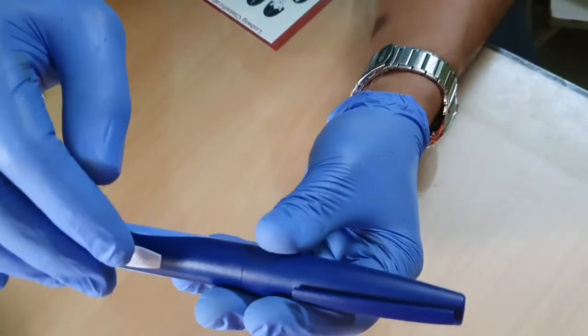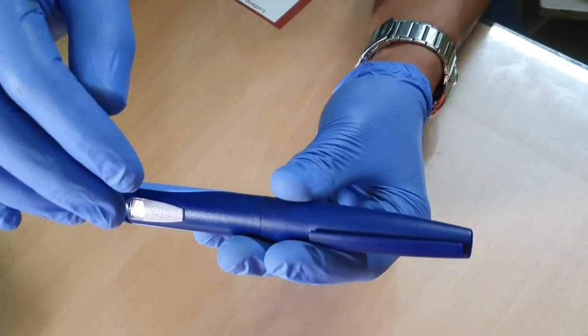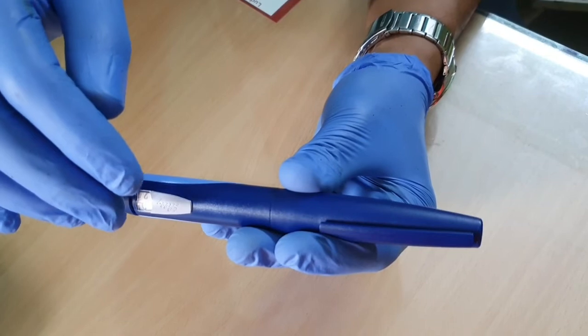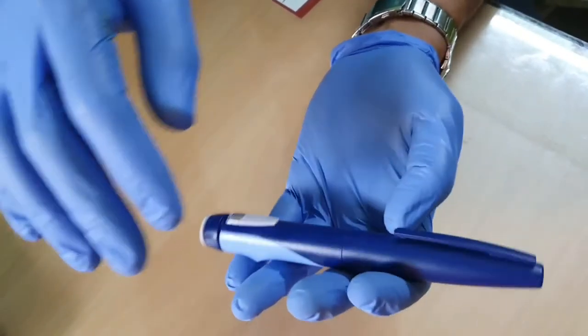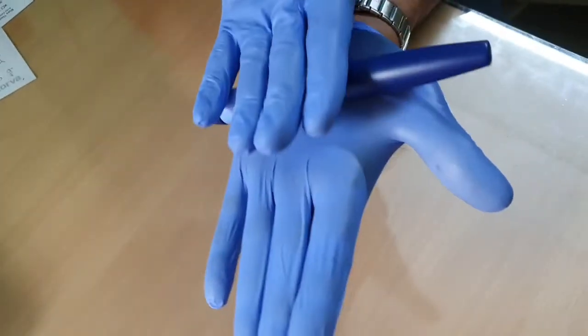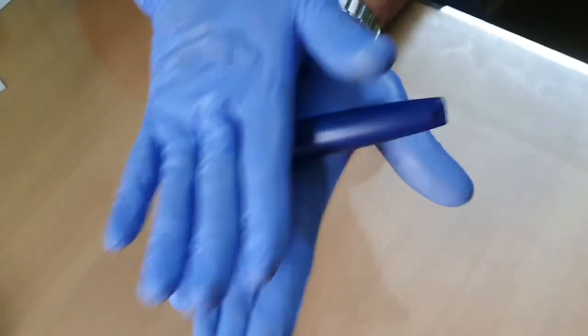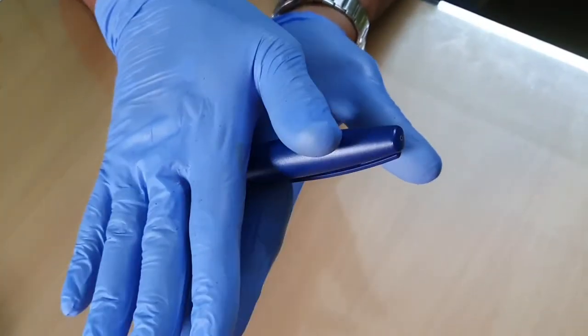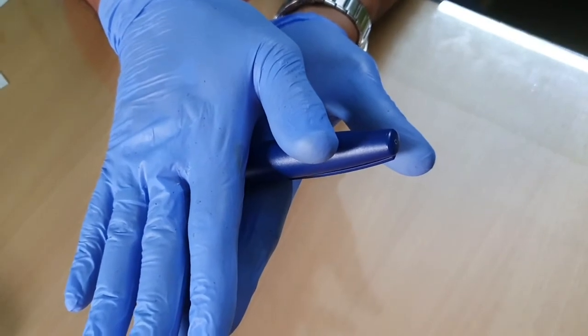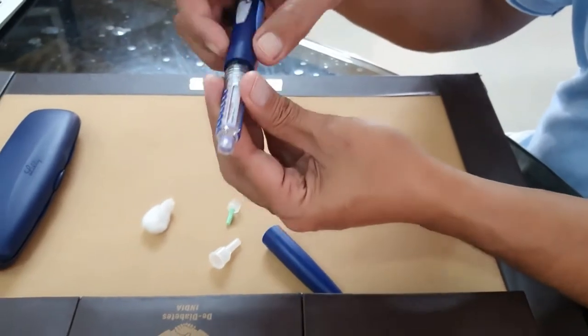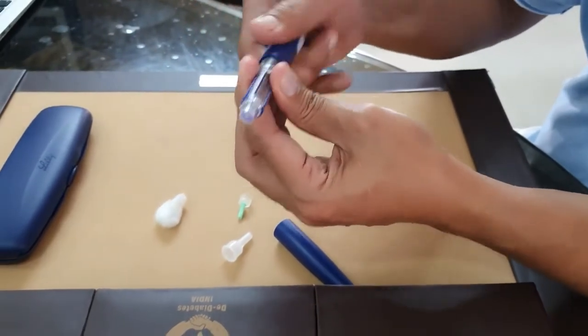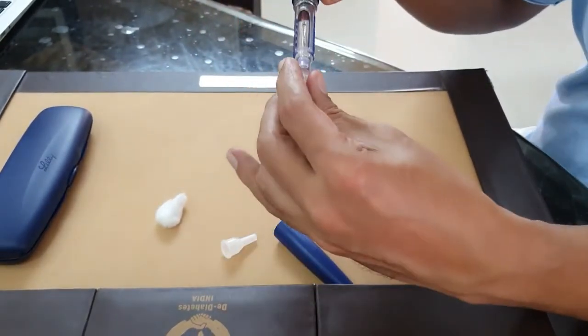As I've told in the main insulin video, every time before taking insulin injection, you should always rotate the insulin pen in between your palm for about 10 times. Never forget to do that.